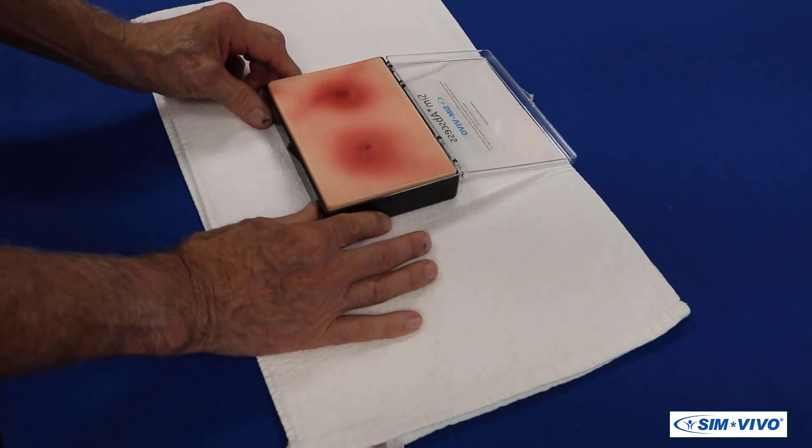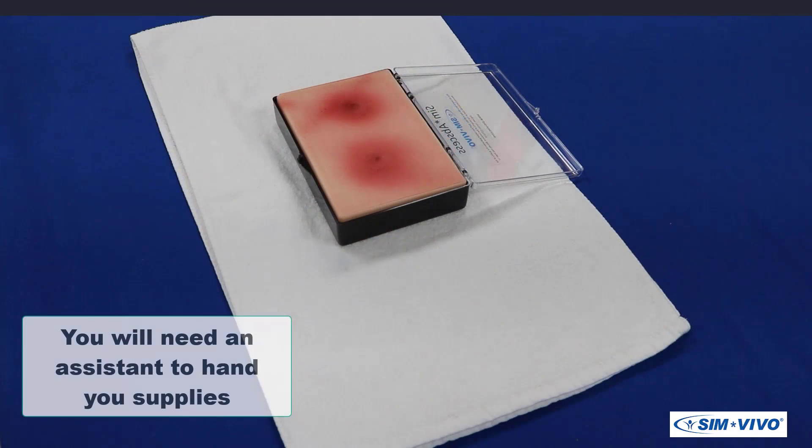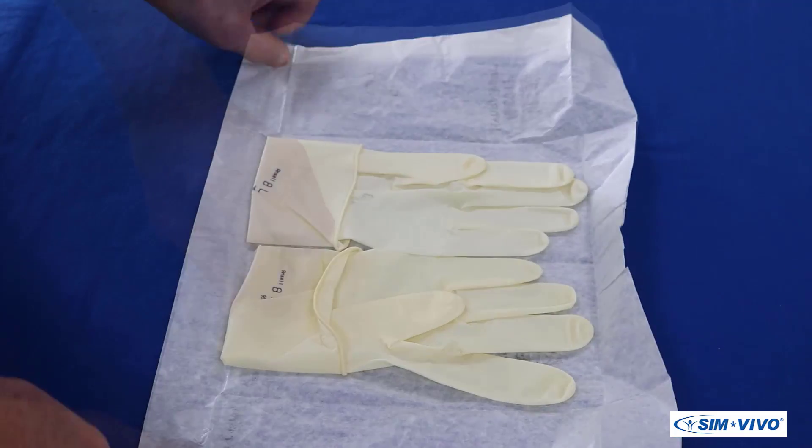Open the sim abscess container and place it in a comfortable position in front of you. To complete the simulation of the sterile field preparation, you will need an associate to act as an assistant to hand you the supplies required for this procedure.